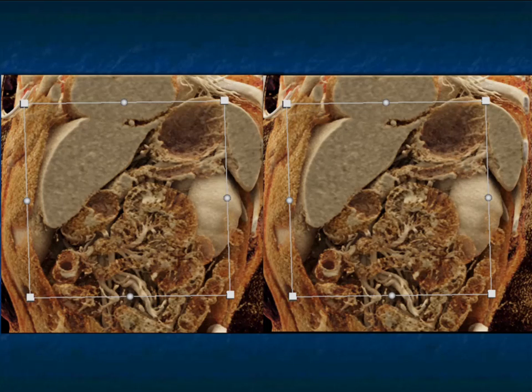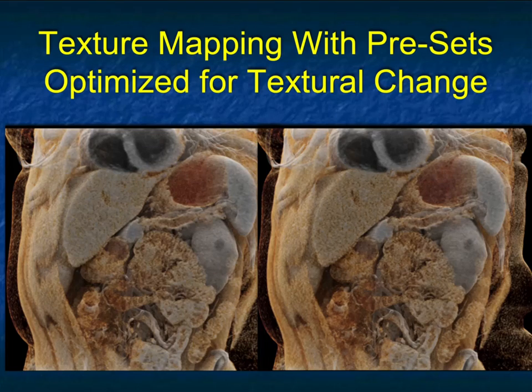So one of the things, again, we'd like to do is automate cinematic rendering, and we're working on that so it's not a lot of the individual variation between how you look at it, and also the fact that most people don't do cinematic rendering. If cinematic rendering works well for detection of pancreatic cancer, we need to get people to use it, but to use it, it needs to be basically automatic.